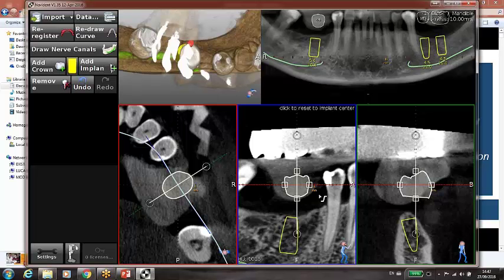And therefore, you can fiddle with this information. In this way, you do have this circle, and you have these squares. The circle needs to be hit, and it gets white, and when it's white, it shows that it's activated. So when it's white and I click on the white and I keep clicking, then I do have a chance to rotate the crown on one side or on the other side.